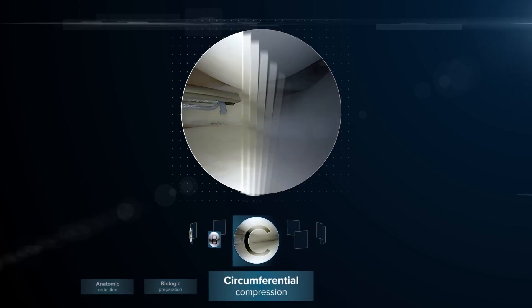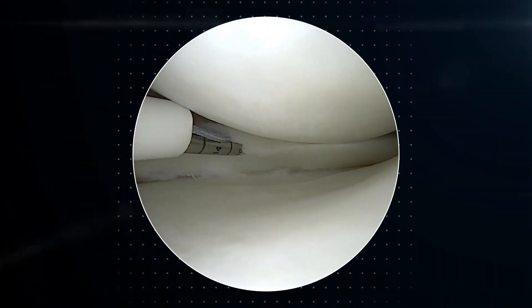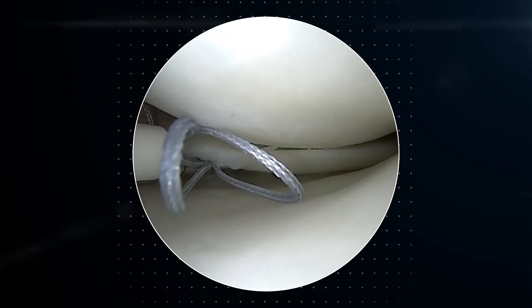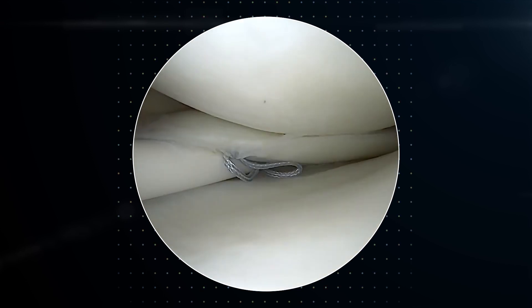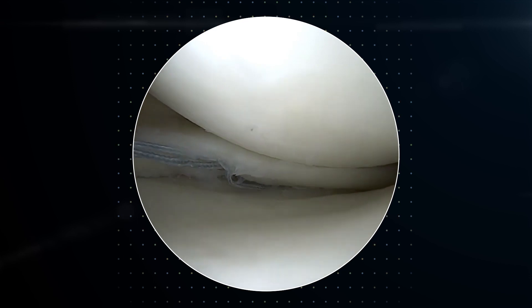Thanks, Aaron, that's definitely an important step. Pat, now that the meniscus is ready to be repaired, let's talk about stitch configuration and tissue compression. Tissue compression is critical for healing, and we know the vertical mattress suture is the strongest construct. It's important to understand the anatomy of the meniscus and its triangular shape. If you put a vertical mattress just on top, you could actually separate underneath the meniscus. It's critical to put a divergent vertical mattress above the meniscus and then come underneath and put another divergent vertical mattress there to close the gap and ensure full compression at the tear site.